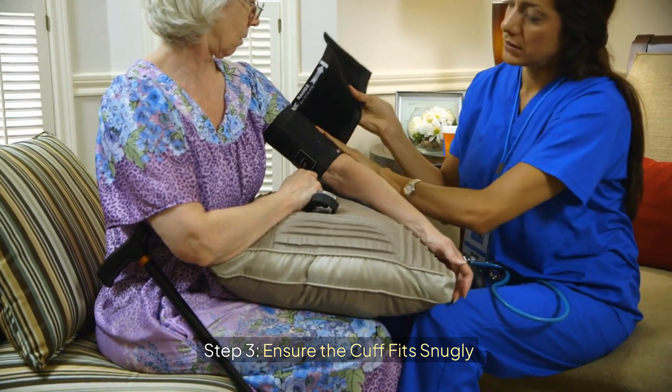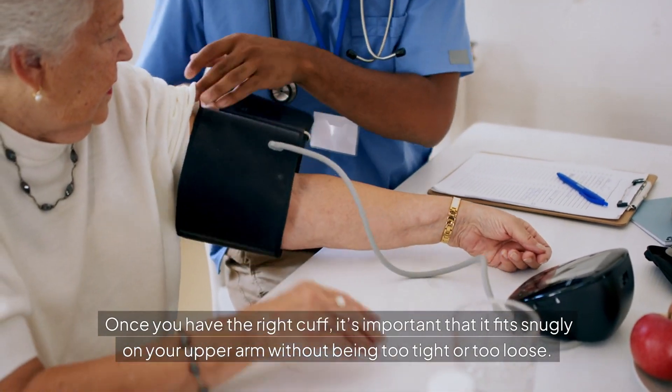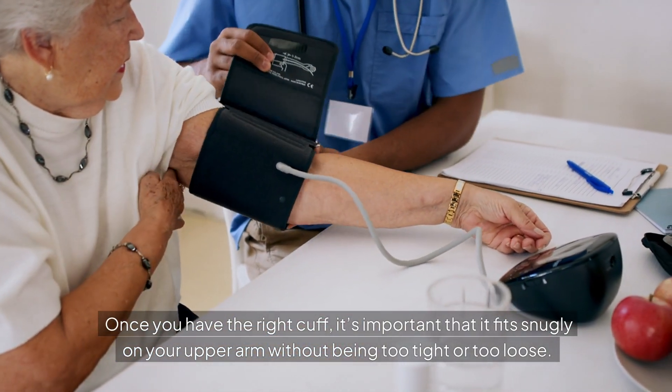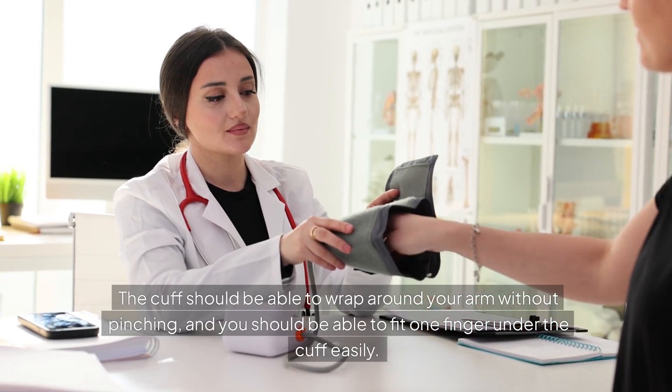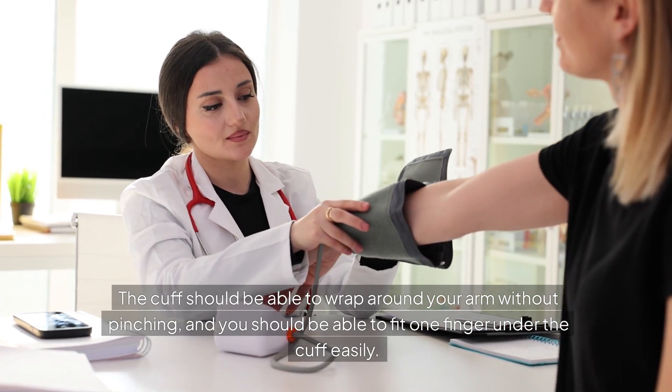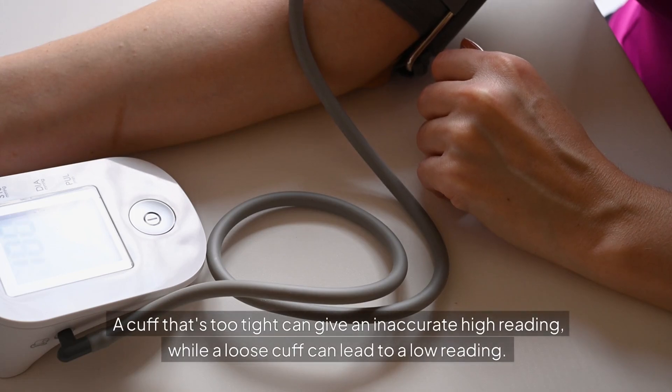Step 3: Ensure the cuff fits snugly. Once you have the right cuff, it's important that it fits snugly on your upper arm without being too tight or too loose. The cuff should be able to wrap around your arm without pinching, and you should be able to fit one finger under the cuff easily. A cuff that's too tight can give an inaccurate high reading, while a loose cuff can lead to a low reading.